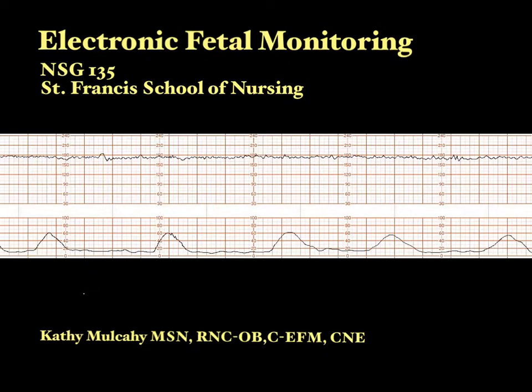that we use. You'll be able to see the basic fetal heart patterns, learn what's considered reassuring and what's considered abnormal, and we'll talk about uterine activity and how to interpret some of the patterns that you'll see in antepartum and in labor and delivery.